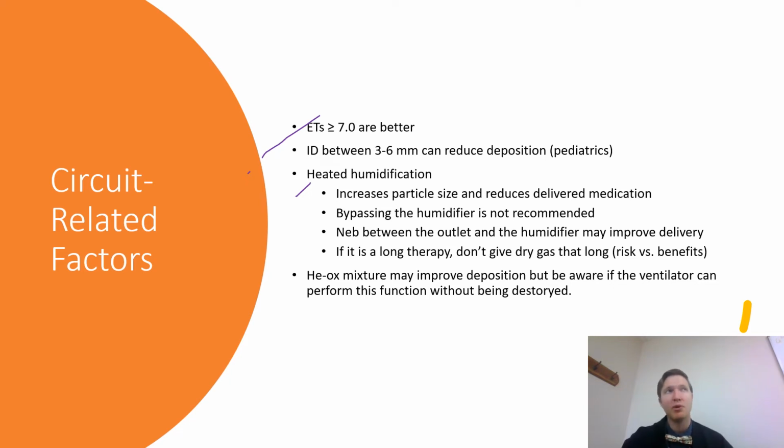Other places, the risk versus benefit, the risk of you not turning the heater back on and having the patient plug off and have cold, dry gas being delivered might be too great compared to that potential extra medication delivery. So they might not want you to pause the heater. So be aware of that policy and procedure.